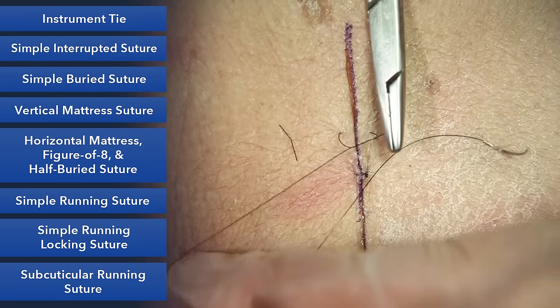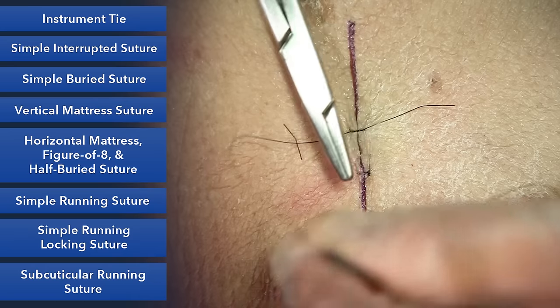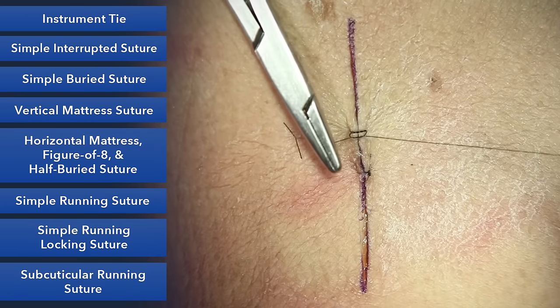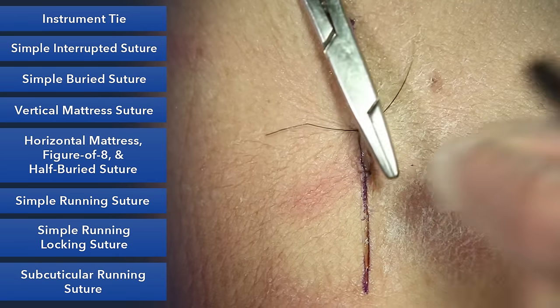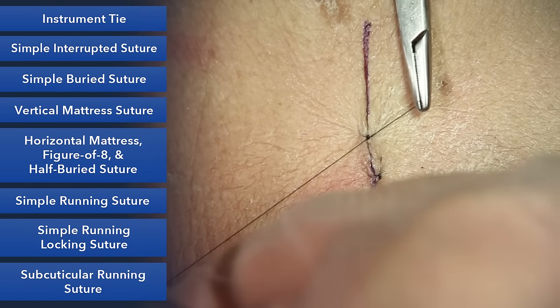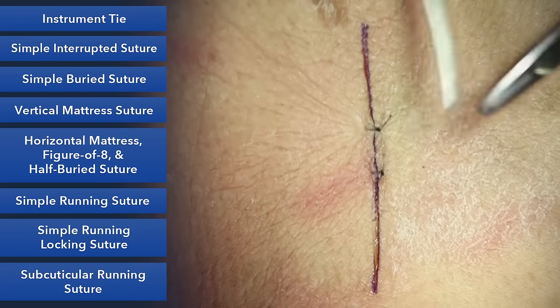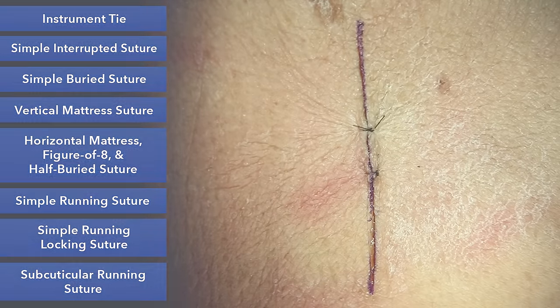Keep the needle driver between the two. Grab the small end. Pull it to the opposite side, squaring your knot. Lock it down with that surgeon's knot. Don't pull up on it now until you grab the end and pull it through for the second time, and now it locks down. Needle driver between the two, wrap once, pull to the opposite side, and keep that knot nice and square. Square knots will not untie. Also, they will look cosmetically more appealing.